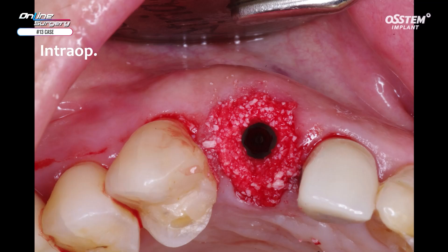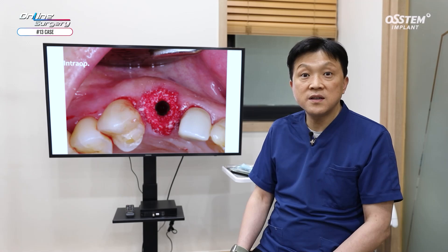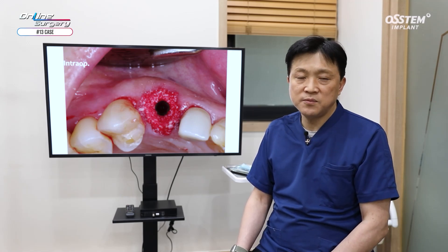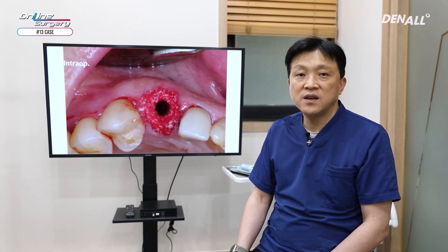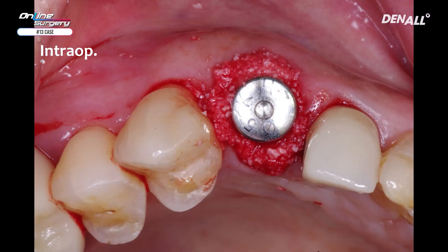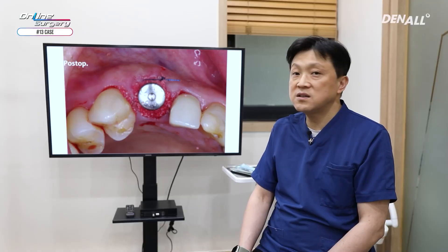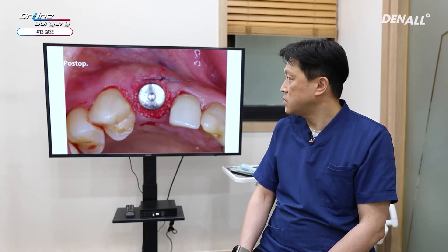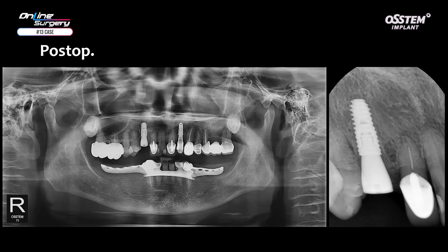At this point, you have two options: connect a healing abutment or provide immediate provisional restoration. In principle, it is better to provide provisional restoration; however, this patient did not want that. Therefore, a healing abutment was connected. To prevent scattering of graft material in the coronal part, a sling suture was done once. No additional incision was used. Looking at the results in the panoramic image, the implant was placed nicely and the vertical position is very appropriate.